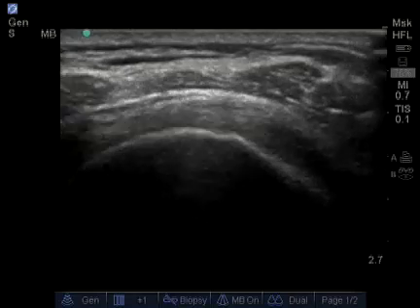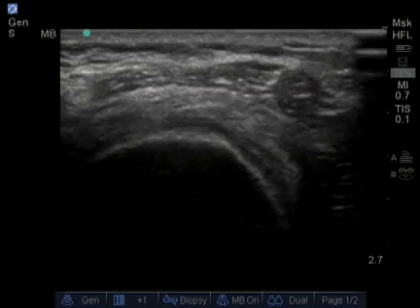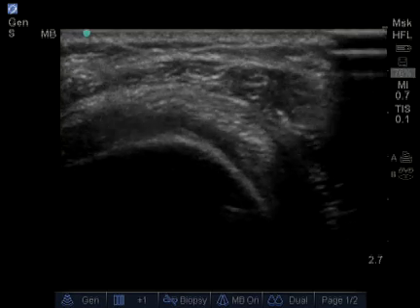On top of the tendon here we notice a little black thin line which is the subacromial subdeltoid bursa. In patients with shoulder abnormalities, this bursa fills with fluid and is often the target of one of our injections.